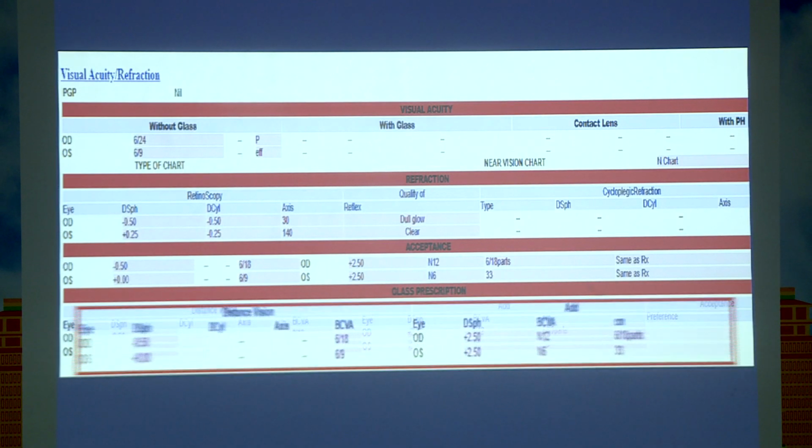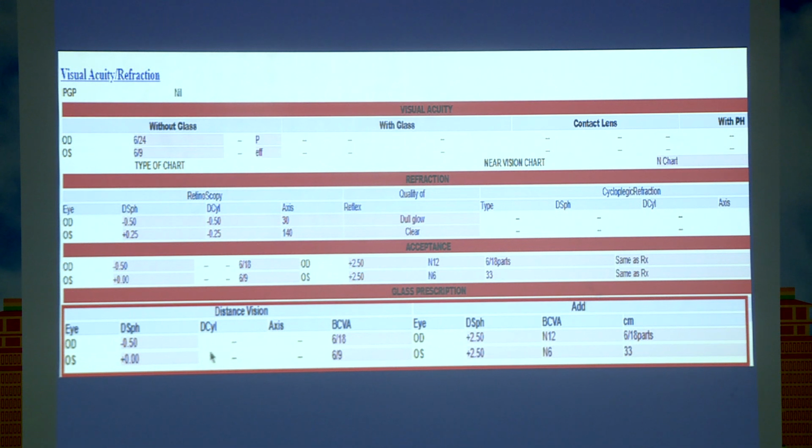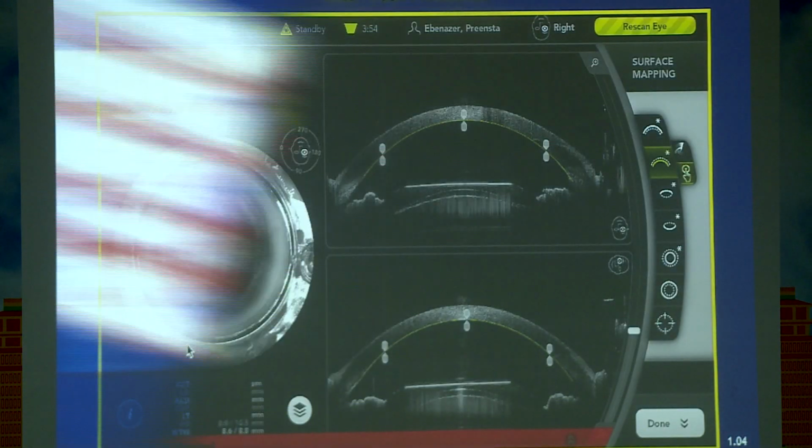And you can see the result that you achieved in this case, compared to the phakic intraocular lens. Obviously, the intraocular lens takes care of the refractive error even better, but this is not the way to do it, primarily because of the retinal complications that can be associated with it.